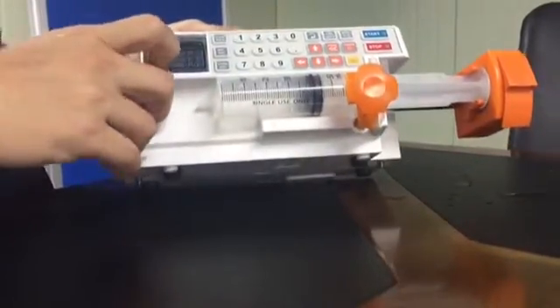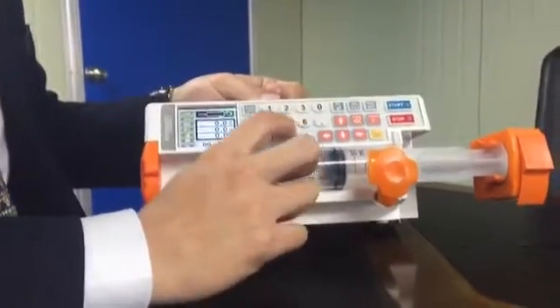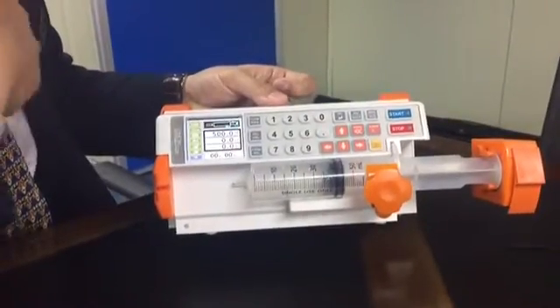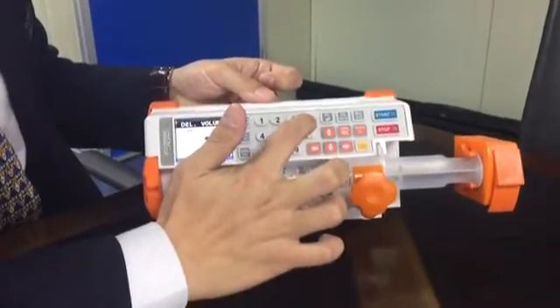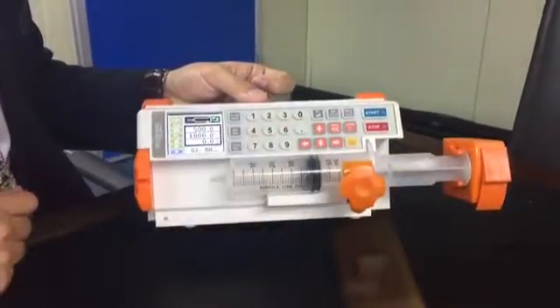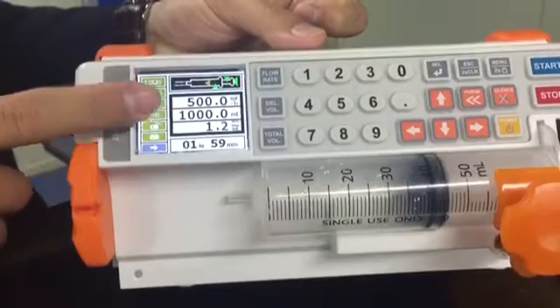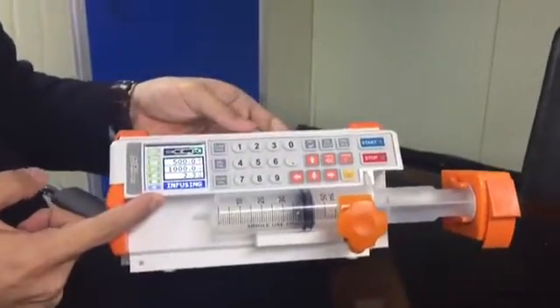You can adjust the values with this numeric keyboard — for example, 500. Then select the delivery volume. Once you start the machine, it will show two hours, meaning you need two hours to infuse a total of 1000 milliliters, because you set 500 milliliters per hour. So it means you need two hours to infuse the total volume that you want.